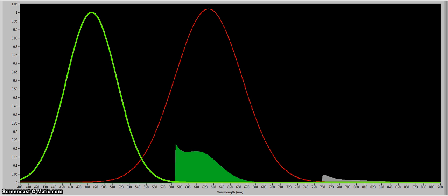And while these were spectrally based analyses, we had done similar analysis to this for things such as illumination uniformity and other critical optical aspects to enable us to refine the design and to generate prototypes suitable for human clinical trials.